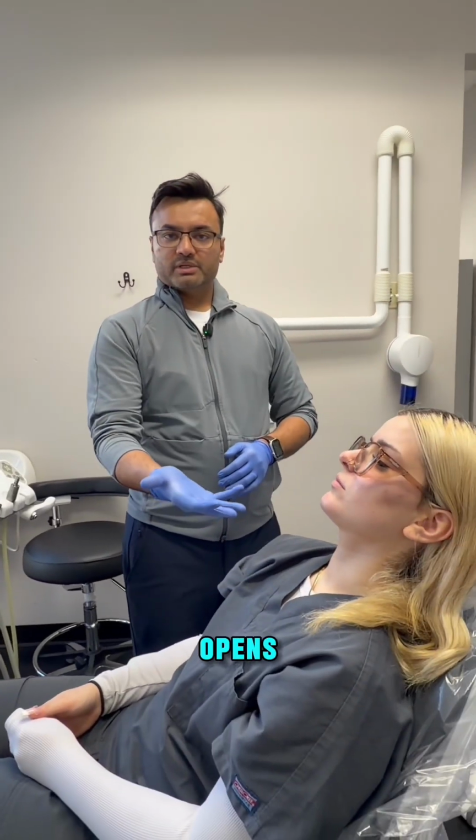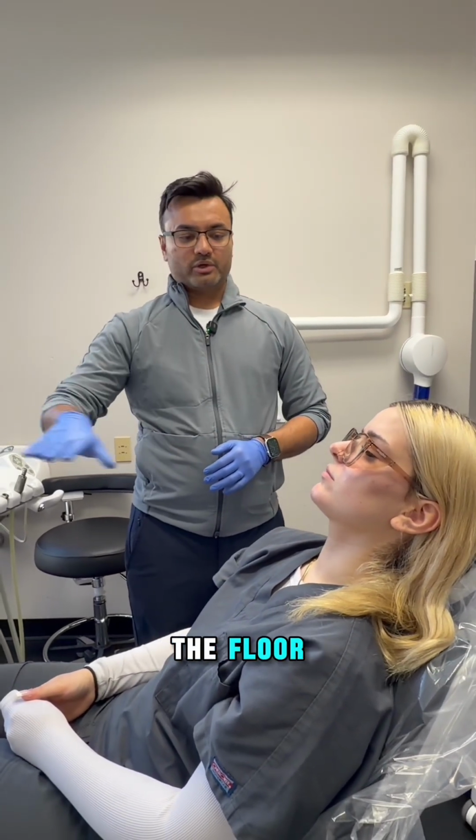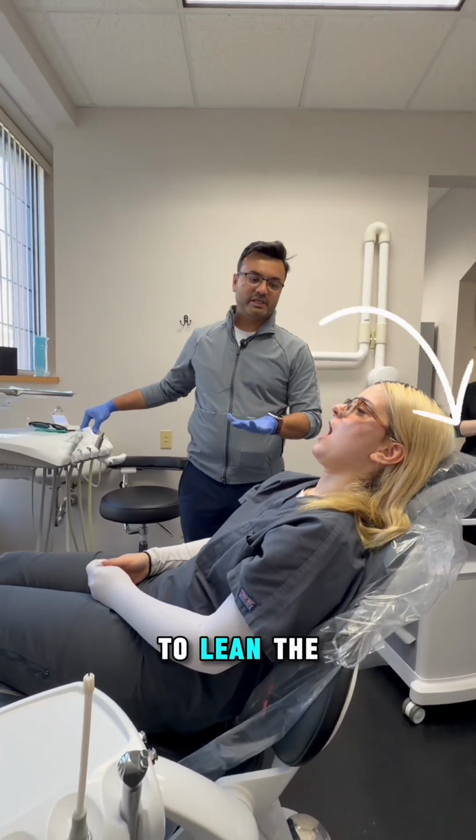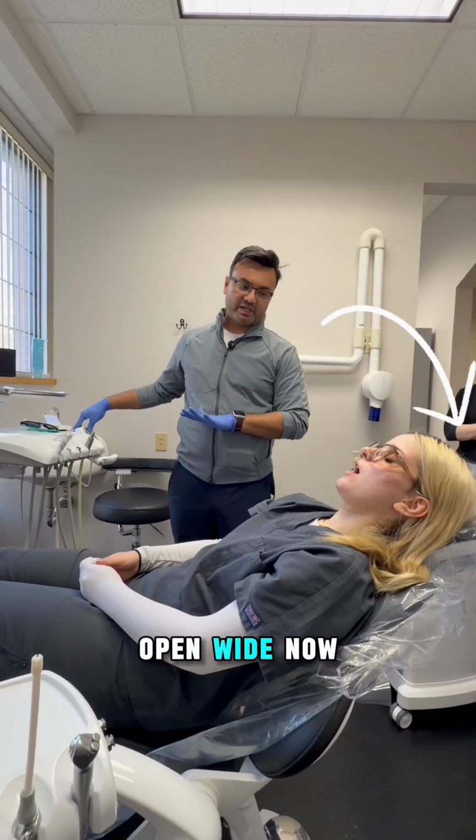When the mandible opens, it needs to be parallel to the floor. Open wide. I don't see this being parallel, so I'm going to lean the patient down a little bit. Open wide.